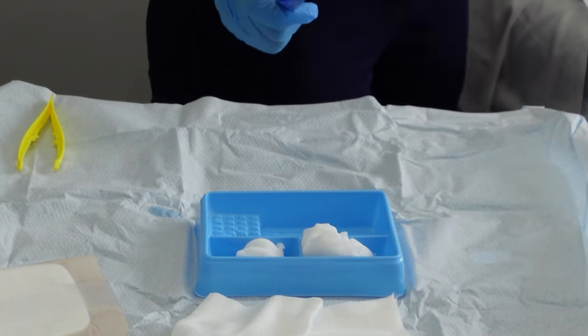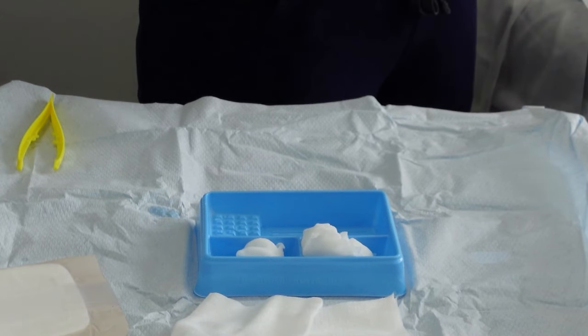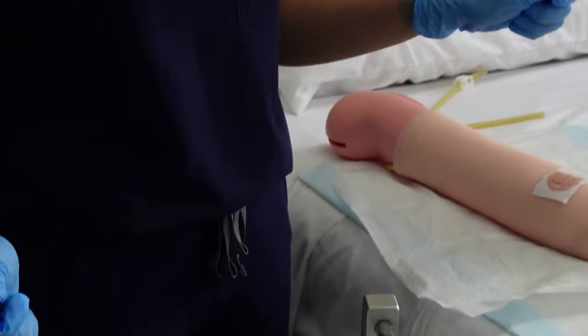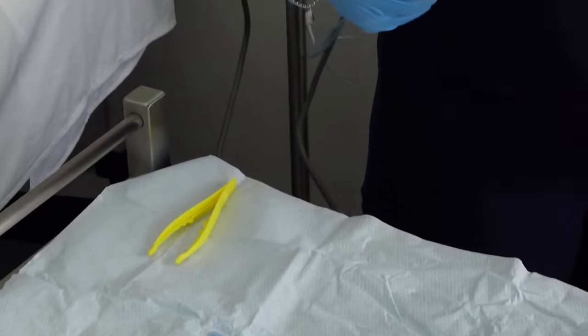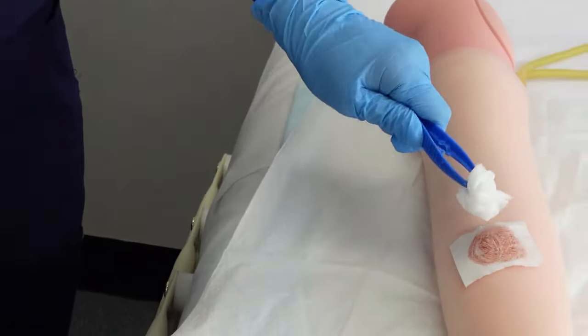Now I'm ready to dress the wound. This is now going to be my clean tong and this is going to be the dirty tong. So very carefully pass the cotton ball into the dirty tong that you're going to be using.